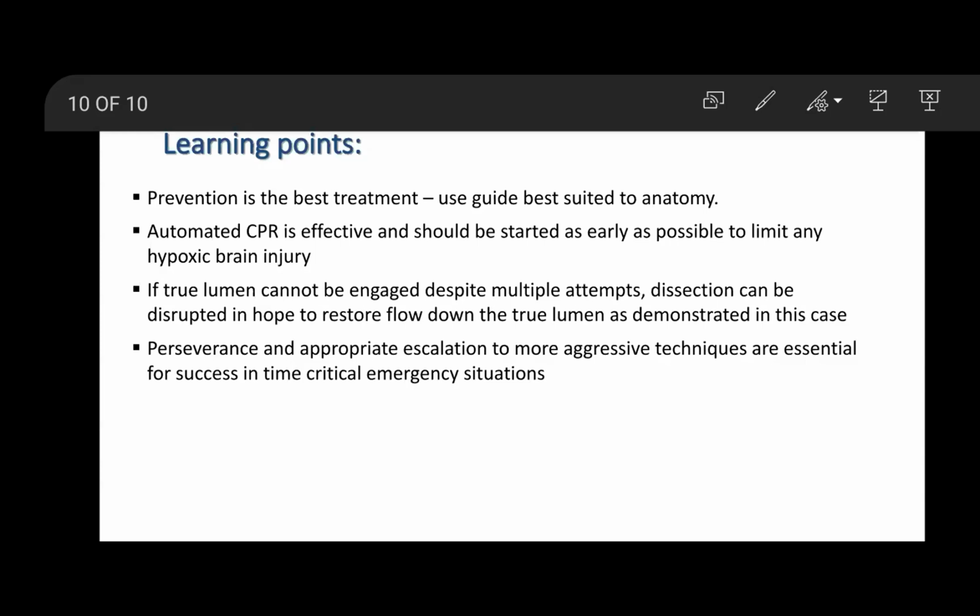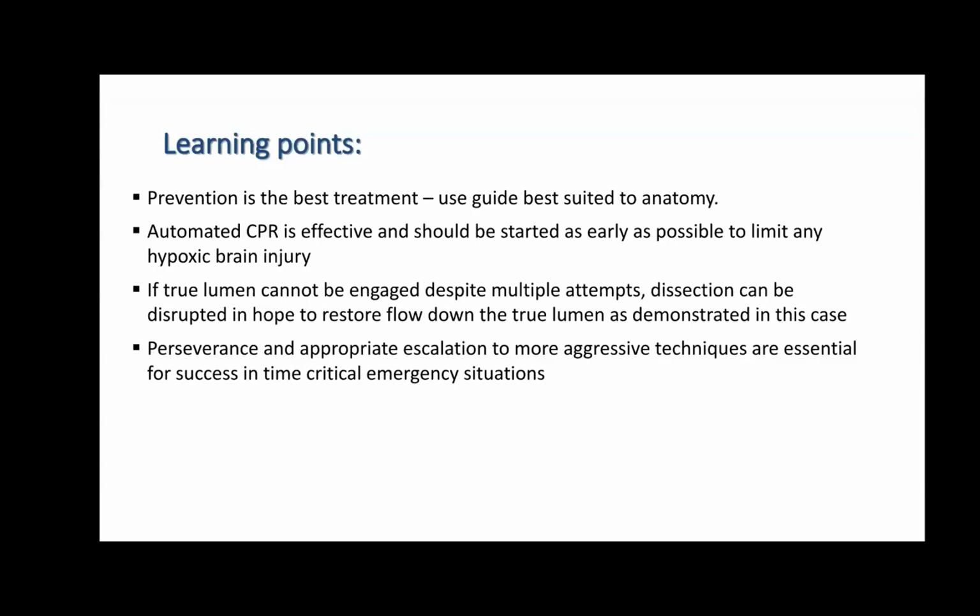To avoid that, as soon as the guide catheter engages, you have a guide wire ready to push into any vessel like the LAD or circumflex. When the guide wire is a bit deep, it stabilizes your guide catheter, and further maneuvering of the guide catheter can be easier. And you can use a second one.